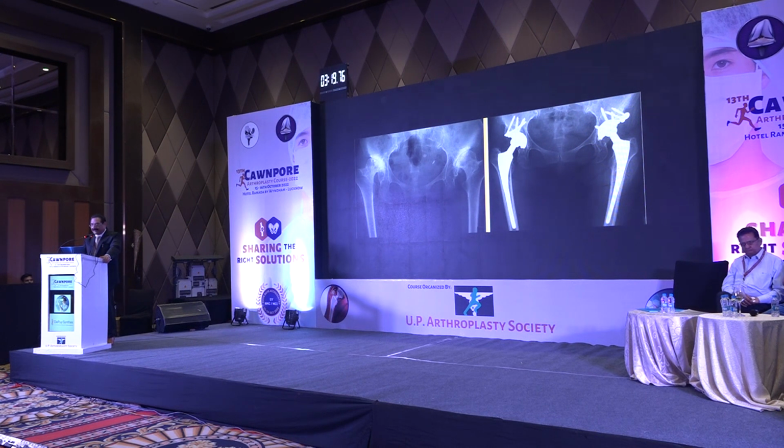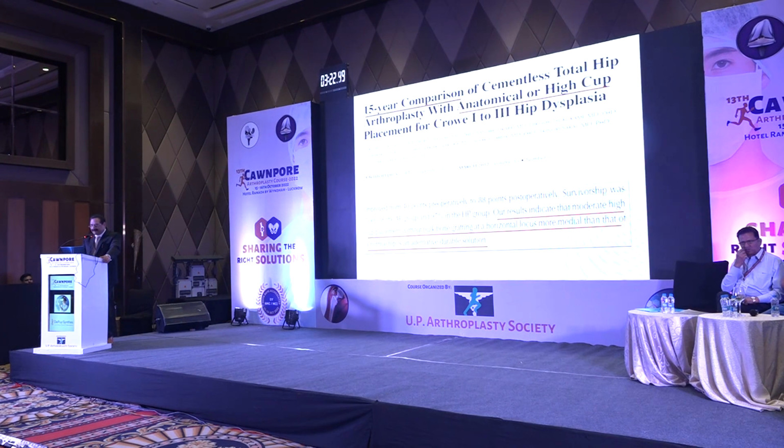Now, how about putting it higher? Is it acceptable? Not acceptable? We should always try to put it in native position. Slightly higher hip center is acceptable. There are various studies. This is 15-year comparison of anatomical high cup position, and the authors say the results indicate that the moderate high cup placement without bulk bone grafting, because bulk bone grafting will have its own problems, at a horizontal locus, more medial, that's very, very important, than that of normal hip, is an alternative, durable solution, thereby saying that within limits you can put your cup at a slightly higher hip center.